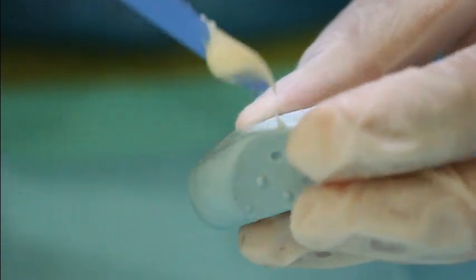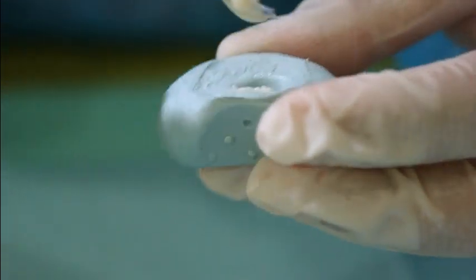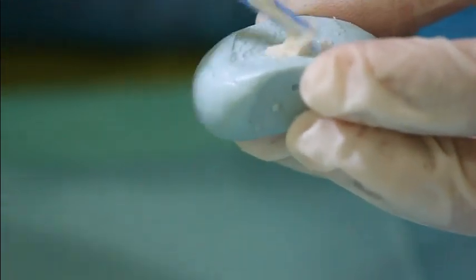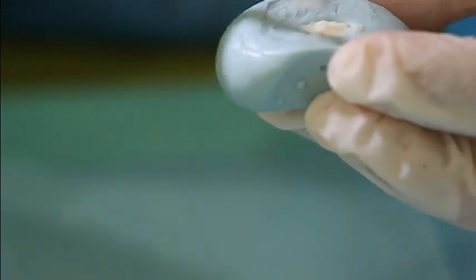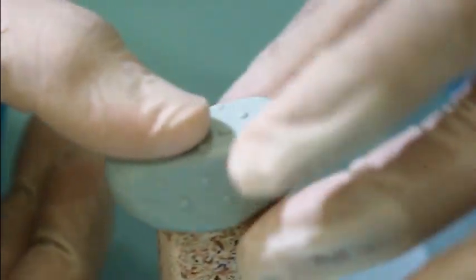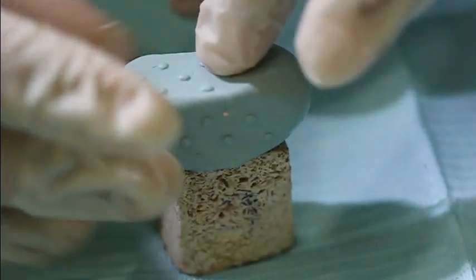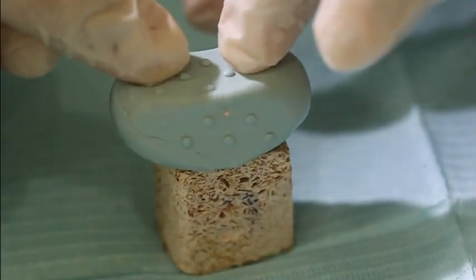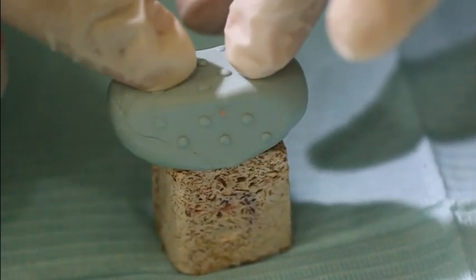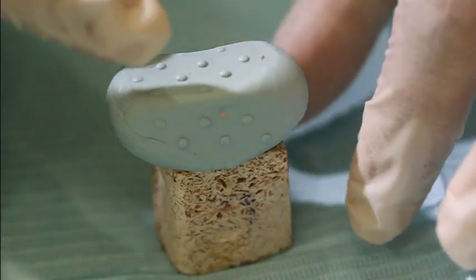Place the Trim inside the putty matrix. Don't press the putty matrix, just apply finger pressure and wait until it reaches the plastic stage. Before it is set, you have to remove it.